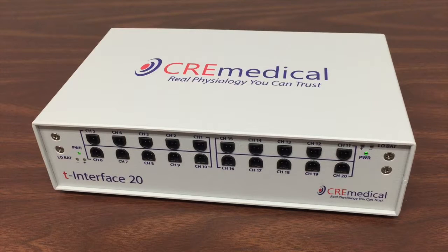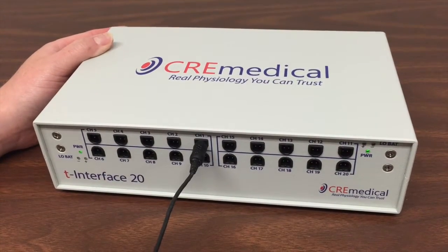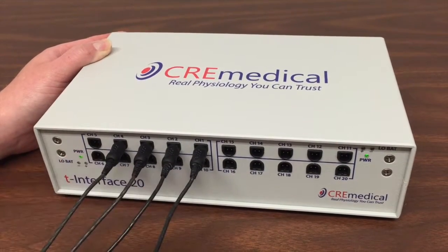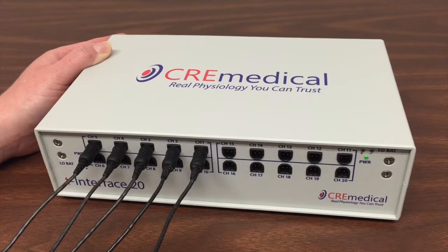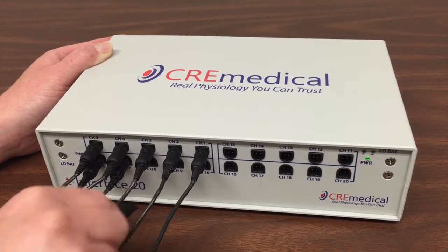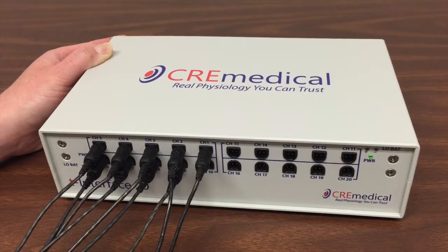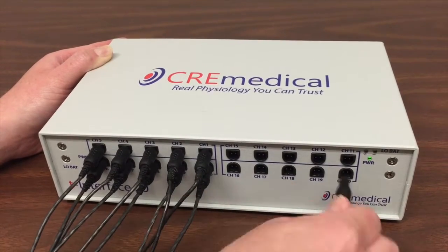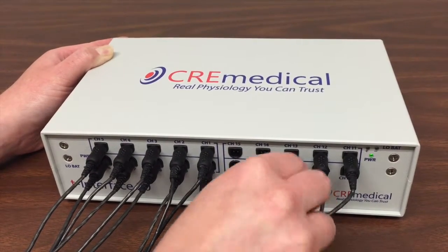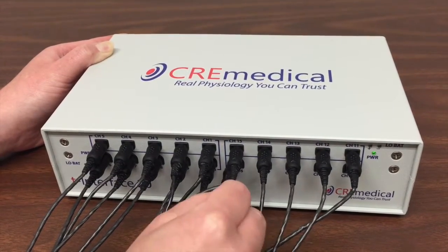We will now plug in 20 T-leads, starting with channel 1. Channel 1, Channel 2, Channel 3, Channel 4, Channel 5, Channel 6, Channel 7, Channel 8, Channel 9, Channel 10, Channel 11, Channel 12, Channel 13, Channel 14, Channel 15, Channel 16.